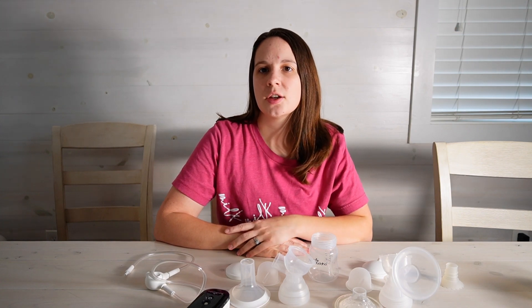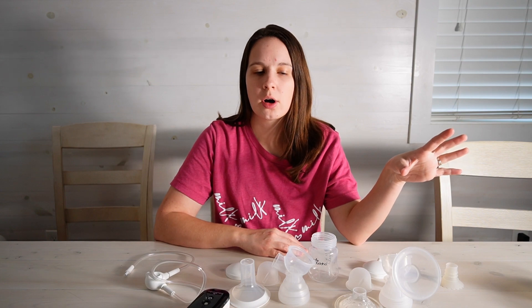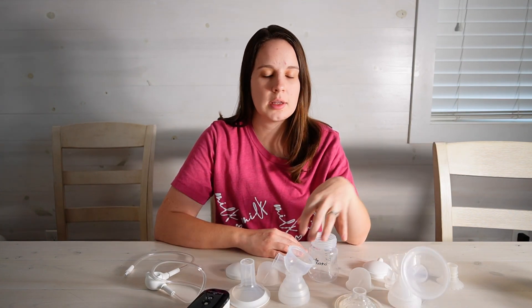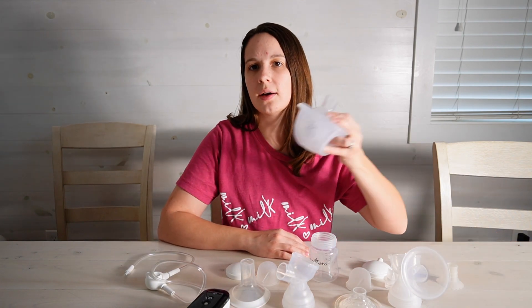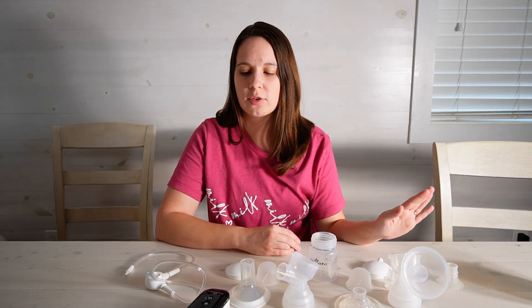Hey everyone! Today I am going to be showing you how to assemble all of your different Baby Buddha parts. I have the one-piece flange here, the easy fit, and then lastly we have the cups. They're all pretty similar but just wanted to run through this really quick for y'all.